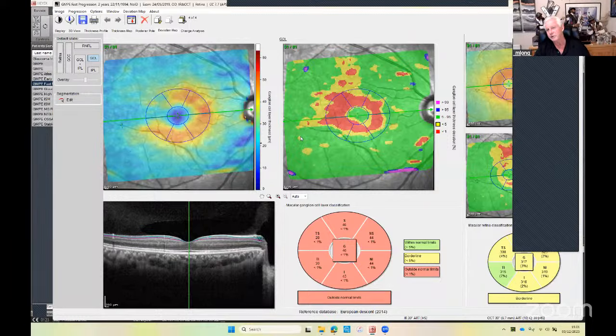We're expecting to follow the horizontal midline and start out here temporally and come in towards the fovea. And this is not quite what we're expecting to see. And then we realize this patient is actually quite young. He's only 24, 25 years old. So is this glaucoma or is this something else? Because this would be normally more associated possibly with MS, possibly with a toxic problem, somebody with a drug problem or an alcohol problem, perhaps.